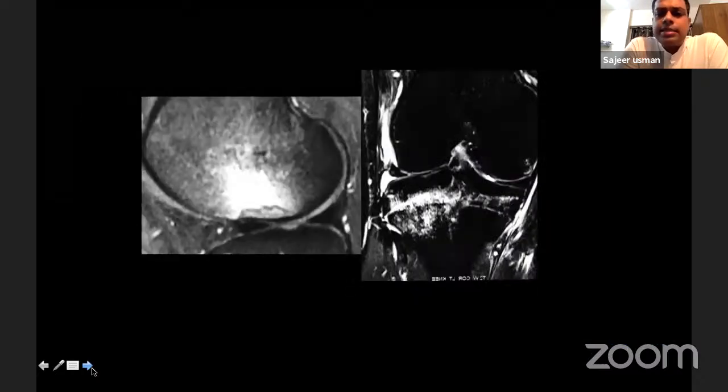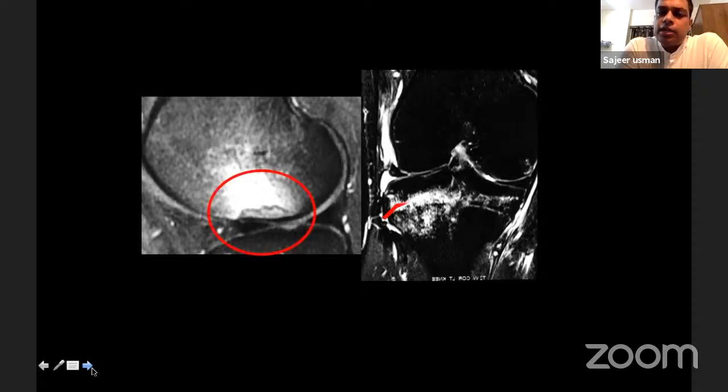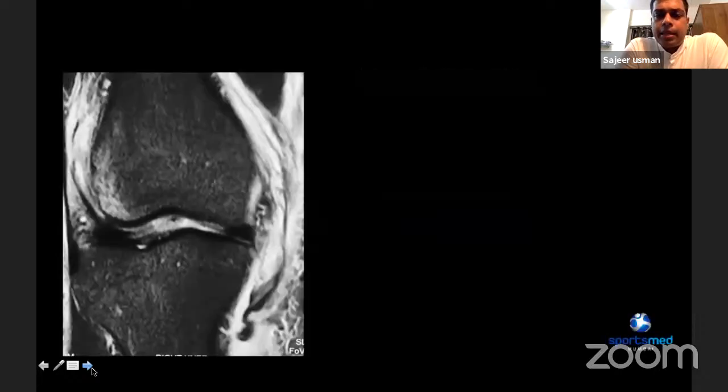Similar thing goes with such subtle fractures, which we can't pick up on X-rays, and probably CT also can't pick up such hairline fractures which are undisplaced. Such patients who have a significant impact bruise may even have a significant fracture of the lateral femoral condyle or the lateral tibial plateau. In such cases, we like to offload the knee and not put pressure on the leg for at least 4 to 6 weeks prior to considering prehab or planning the next step.